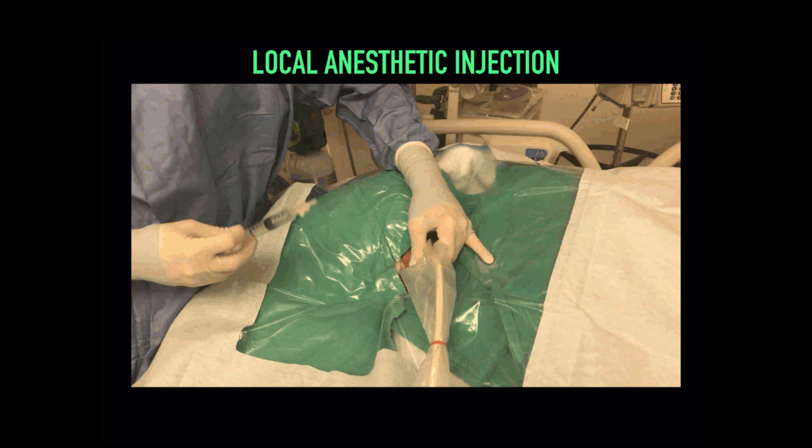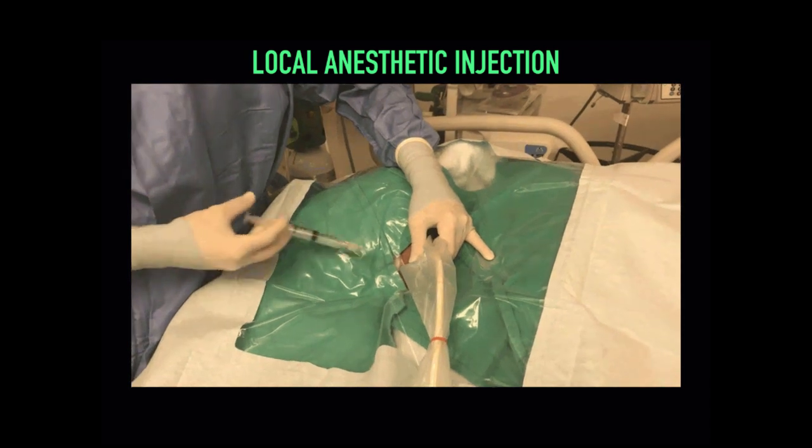So we can use a technique of visualizing the needle to help. First of all, freeze the skin of our planned site of entry.